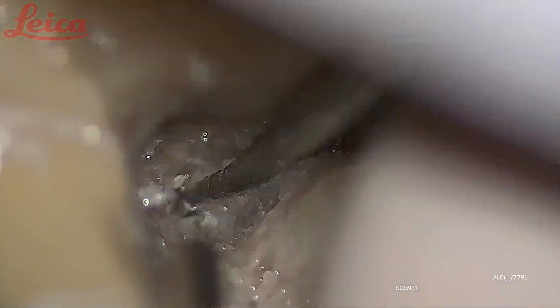In fact, we decompress the labyrinthine segment through the trans-canal approach as well. I will show you that — it is a very simple procedure, especially in cases of road traffic accidents with longitudinal fracture of the temporal bone. The trans-canal approach is very useful in such cases.